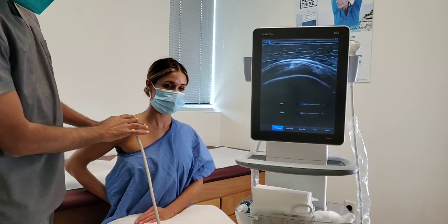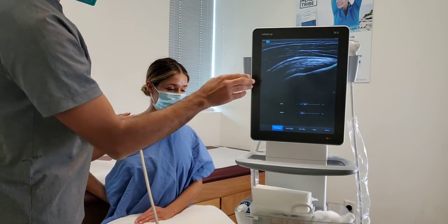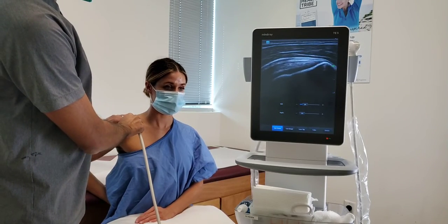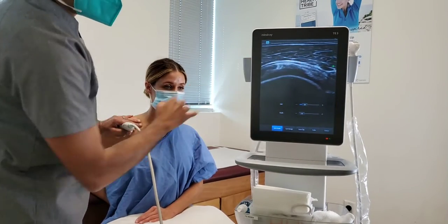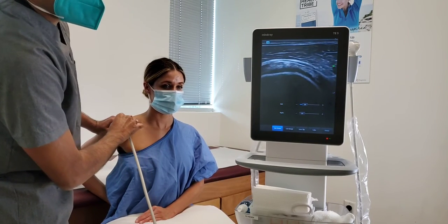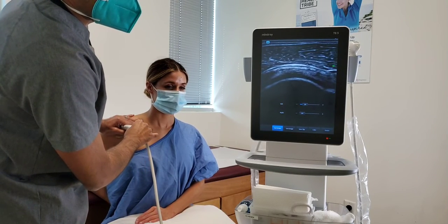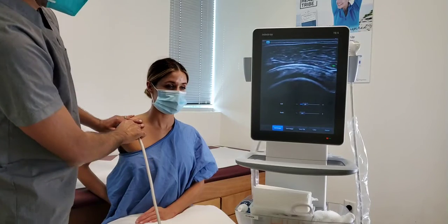Now I flipped my probe here. So before I was looking at the tendon in this direction, all the fibers parallel. Now I'm actually going in cross section, so the fibers are coming at me here. And again, I'm going to look at the tendon at all different angles and see if I find anything that could be irritated, something like a tear or anything along those lines. And again, we notice that bursitis that's sitting up top there.